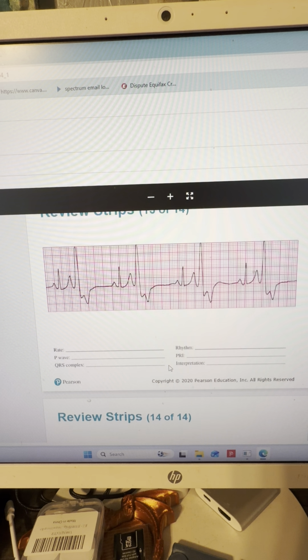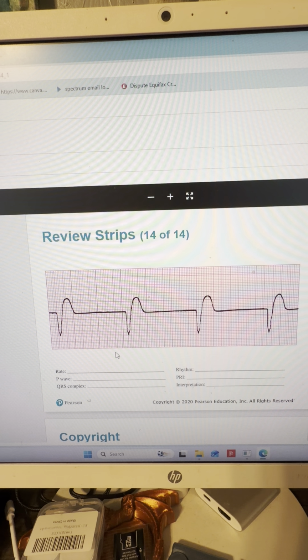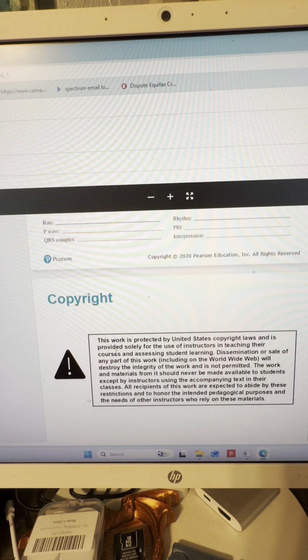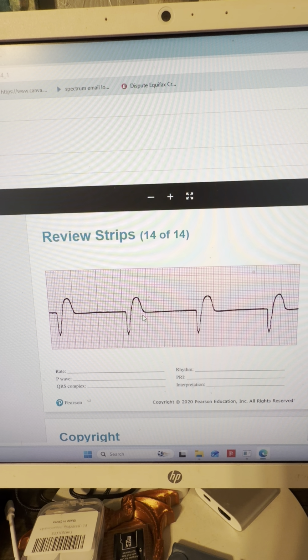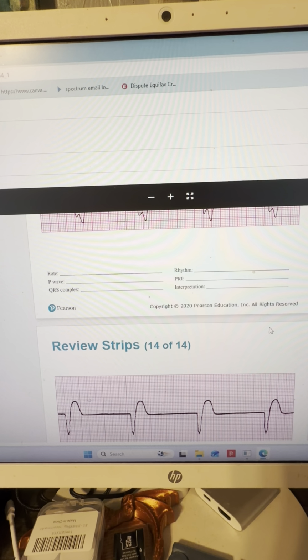This is bigeminal PVCs. This is wide; now if these QRSs were skinny, this would be junctional, but they are wide and bizarre, no P waves, so this is idioventricular rhythm because it's still between 20 and 40. If this was a rate of 60, it would be accelerated idioventricular rhythm. And those are all of your ventricular dysrhythmias.